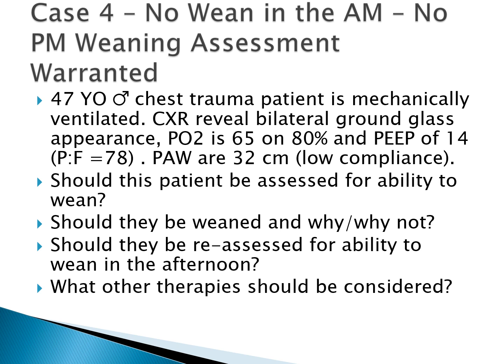The patient is mechanically ventilated, of course. Chest x-ray reveals a bilateral ground glass appearance. PO2 is 65 on 80%, so they have a crappy P to F ratio, really crappy. It's south of 100. PEEP of 14, so it's not a COVID-19 patient, but it could be. Peak airway pressures are 32. The plateaus are maybe 30, so the patient has low compliance.